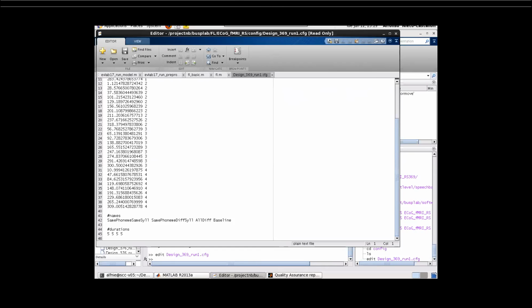When you specify a number of onsets and times, SPM has a way to derive the actual regressors by convolving that with the HRF, but it's not actually convolved at the resolution of your scans. It's converted to this micro time resolution first, and then converted back. In the process of doing that, I think it's doing some correction for this. So I'll have to go and check whether you still need it. In previous versions, when you applied the slice timing correction, if you were using the mid slice as the reference slice, you needed to correct, and if you were using the first slice, you didn't.